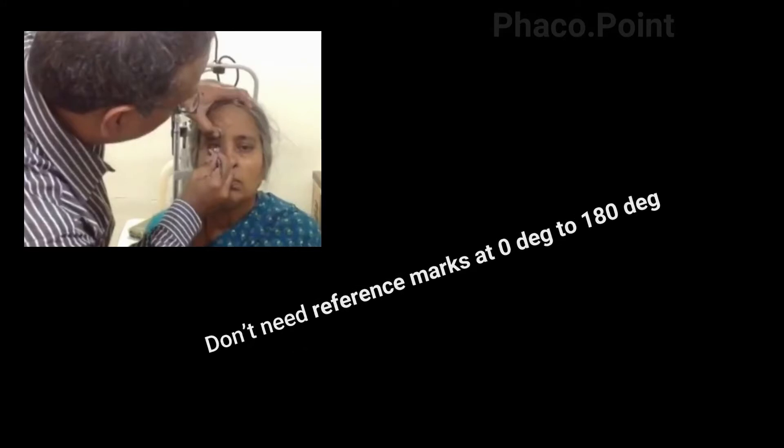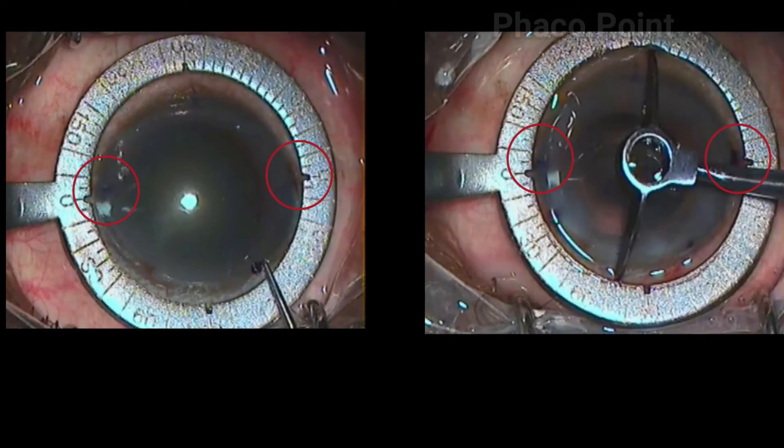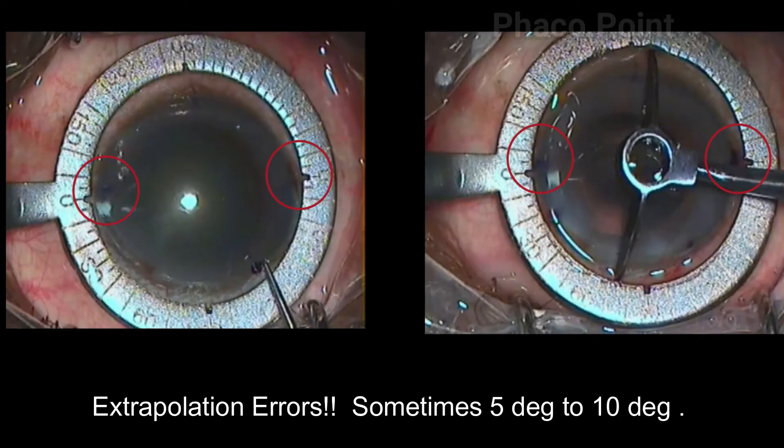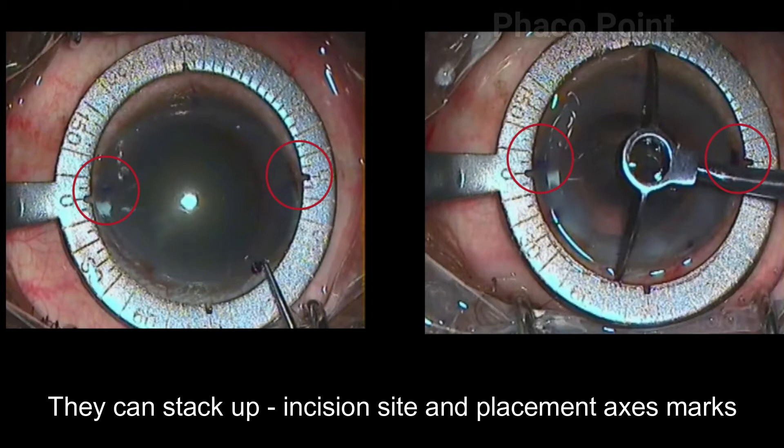The second thing I decided to do away with were the reference markings at zero and 180 degrees, because based on these reference marks the axis of placement and the site of incision marks were made on an extrapolation basis. I found that there could be errors while performing this extrapolation — both while marking the site of incision and while marking the axis of placement — and these errors can add up to a significant error of sometimes 5 to 10 degrees.